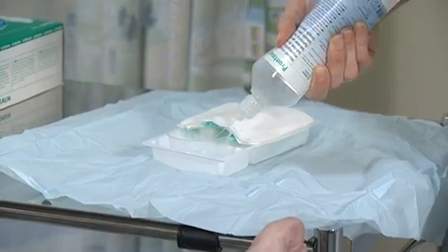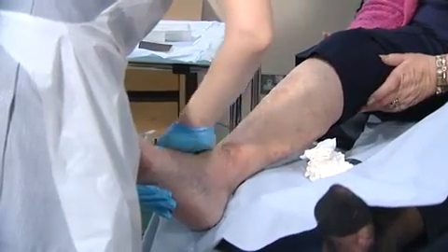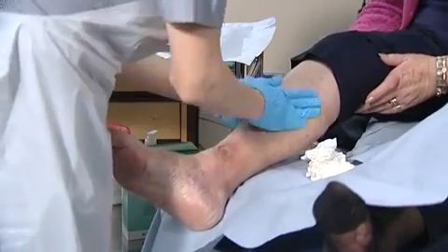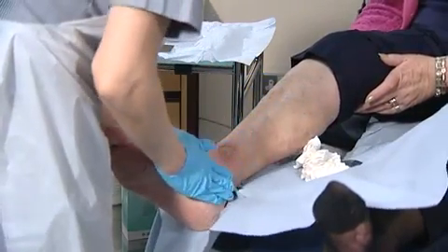Irrigate the wound using Prontosan. Dry the edges of the wound to prevent the adhesion of the dressing, and if necessary, apply an emollient to keep the skin hydrated.